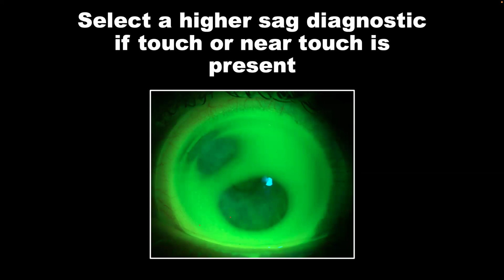That's why we don't have to stress and make many changes to achieve a more symmetric fluid reservoir. So in this particular case, I will go to 400 microns in difference, because I know I have touch and I want to leave a good lens settlement after use.